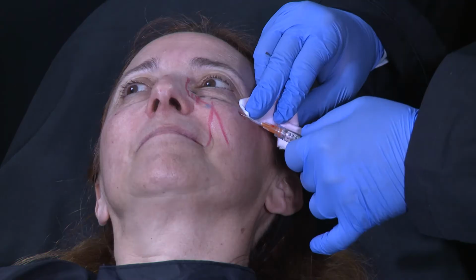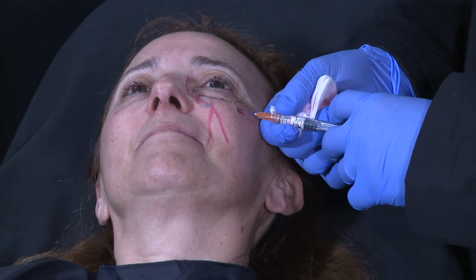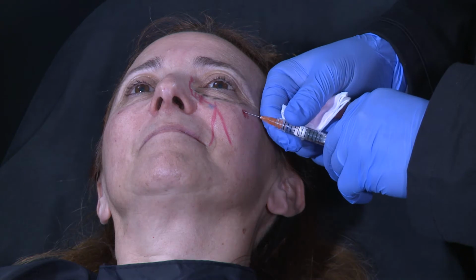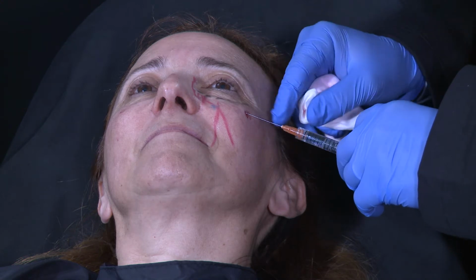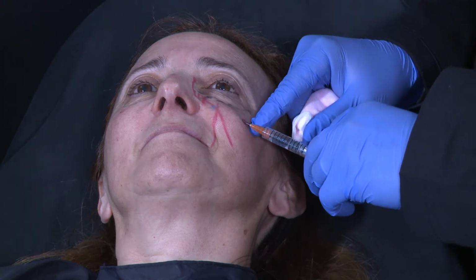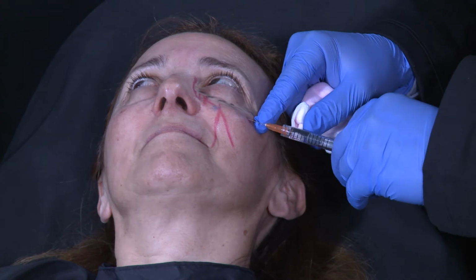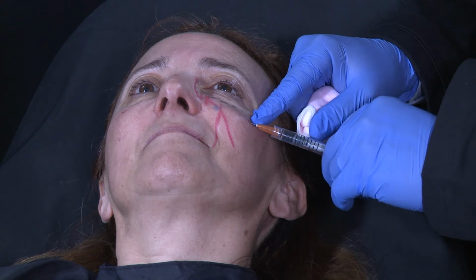Thank you very much. Look up. So you see I'm at the top. I inject slowly. You see my product here, dark. Slowly. So I don't need a lot. And because my cannula is very long, I can reach, you see where I am? I'm here, the last dark spot. It's because I don't do any massage, because I don't want my product to spread away, because I put it in the right place.